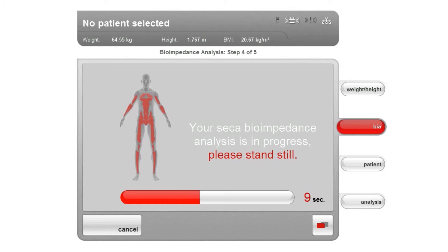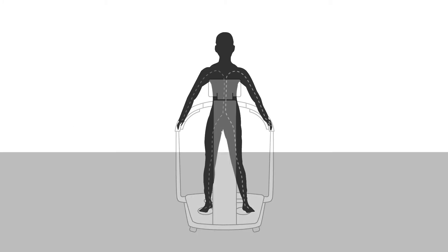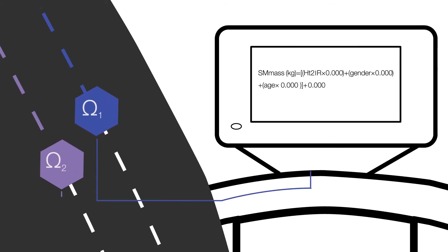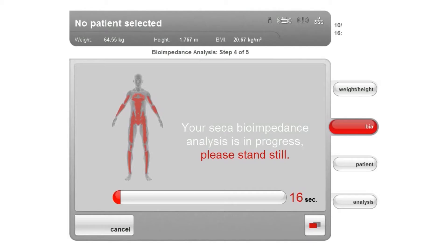The measurement then starts automatically. During the measurement, a small, imperceptible current passes through the body of the test subject. The resistances which oppose the individual body components to the current supply the data with which the body composition can then be calculated. The remaining duration of the measurement is displayed. After the short measurement time of approximately 17 seconds, the SECA MBCA immediately calculates the measurement results of the selected parameters using validated formulas.